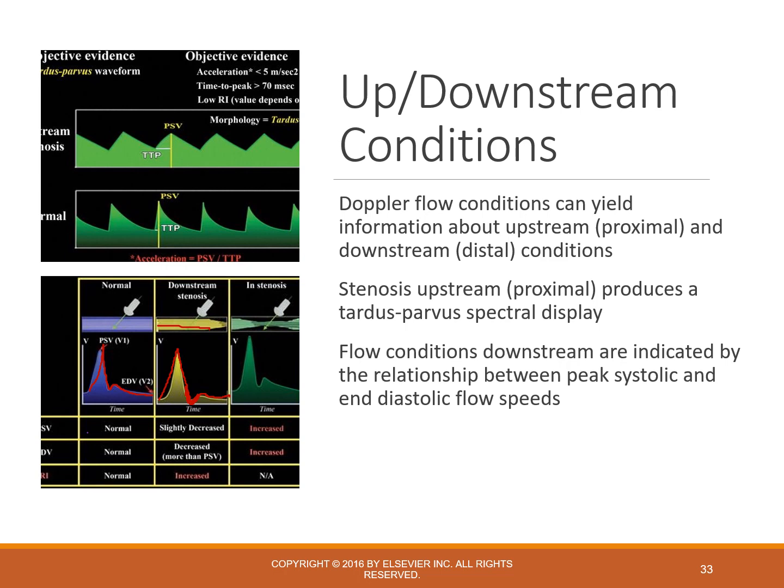Now here, once you get into the stenosis, the waveform in the stenosis is going to look pretty much as normal. So you still see good systolic upstroke. You're in the stenosis now, so you don't have anything ahead of you that would cause resistance. So you're going to see more of a normal waveform where you get this little dip in the early diastole, then it moves forward through the rest of diastole. But what's going to change in the stenosis is that increase in velocity. So you're going to have your velocity peak here in the stenosis with that reduction in pressure. So if you're scanning down a vessel and you're seeing your waveform change, it's going to tell you what's ahead.